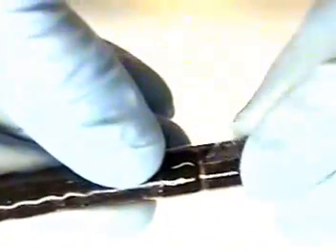Base of the second glue joint, bringing the tape around 2 to 3 times. This will protect the insertion tube from cutting and nicks, from Dremeling or filing.